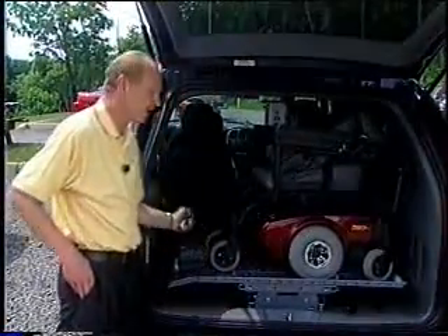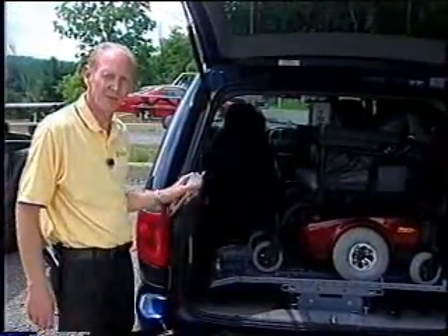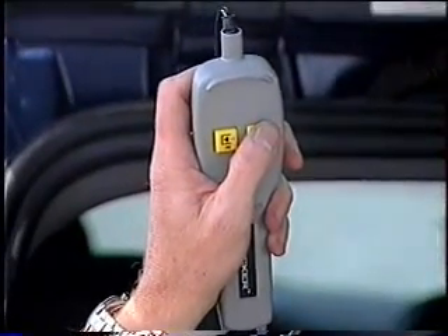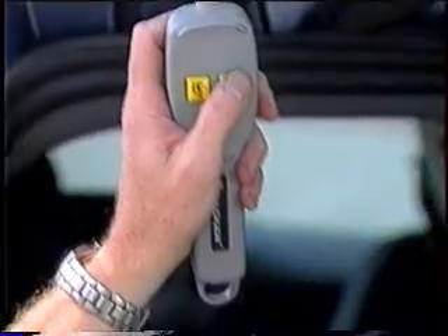This is the Tracker by Freedom. It's an inside platform lift. All the customer has to do is push the button. It does come with an RF unit or handheld unit automatically. This lift requires no drilling in the vehicle.